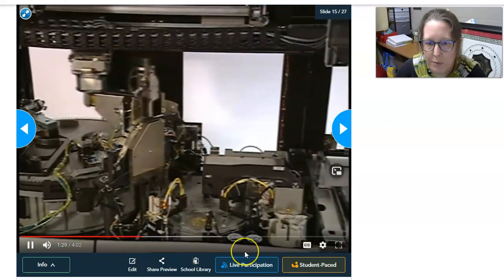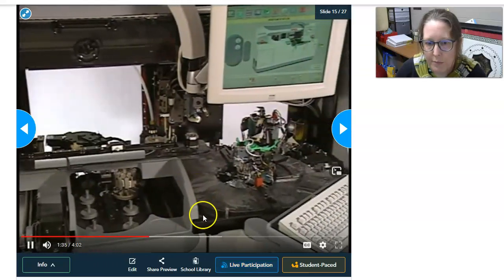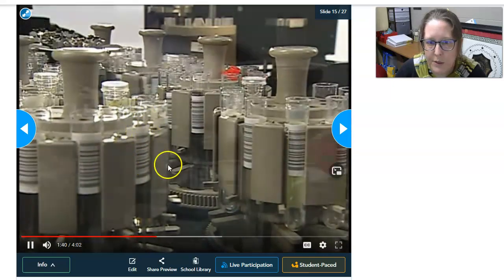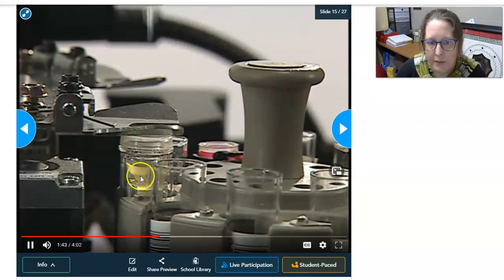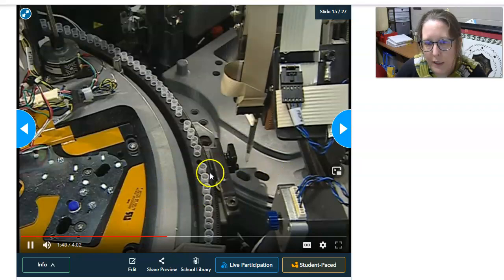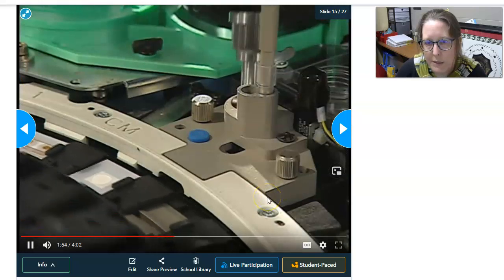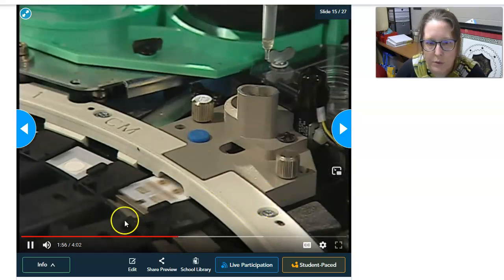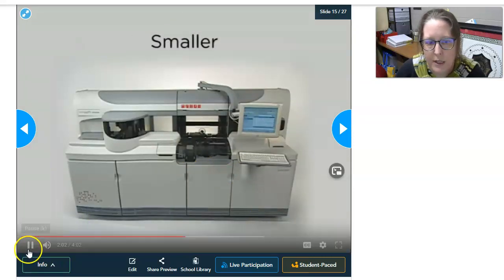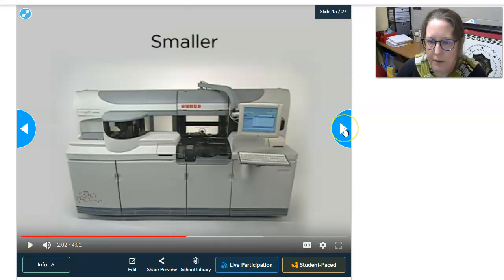So you can see now a little bit of the inside of it that you normally don't see while it's running, picking up, dispensing, all of that. You see the barcoded specimens, so it knows what to do with it. This is a small sample cup. Sometimes they have a small volume, so you have to put it in that type of adapter. It's picking up reagent tips here, and then disposes of it. You can see all kinds of cool stuff going on. Anyway, it's slide technology, which is really cool. We're going to talk about that here in reagents. So small volume, lots of testing, big menu, kind of neat.